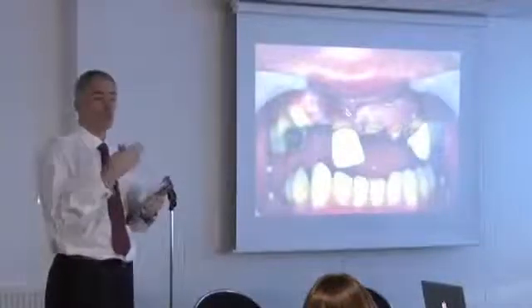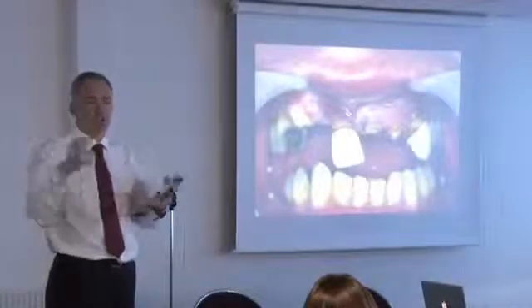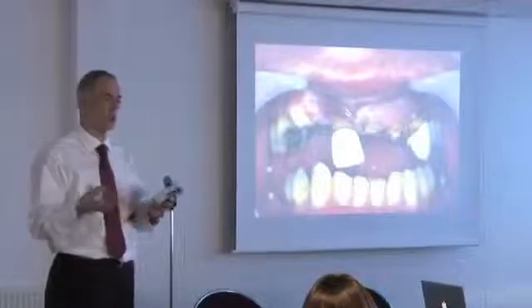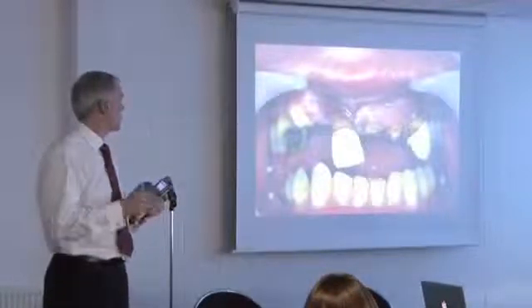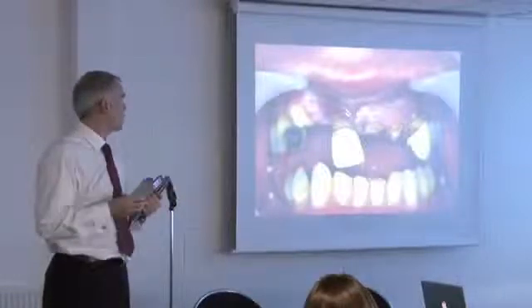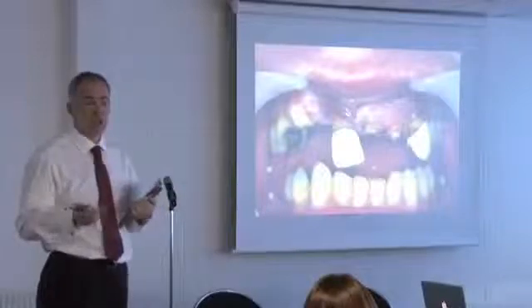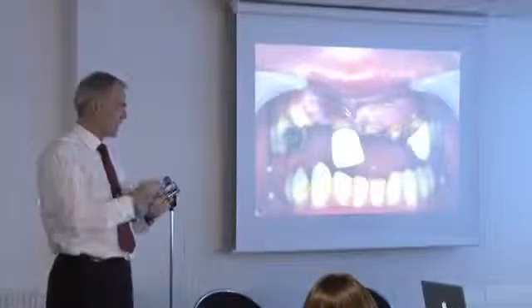So what I would do, we're general practitioners, we know how to do all sorts of dentistry. Why do we do it all at the same time? It's to the benefit of the patient. So book a long appointment. Bring the patient in, cut the teeth off that you want to hang on to as overdenture abutments, root treat them there and then, or stabilise them if you haven't got enough time for the root treatment, and then take the teeth out that you want to take out.